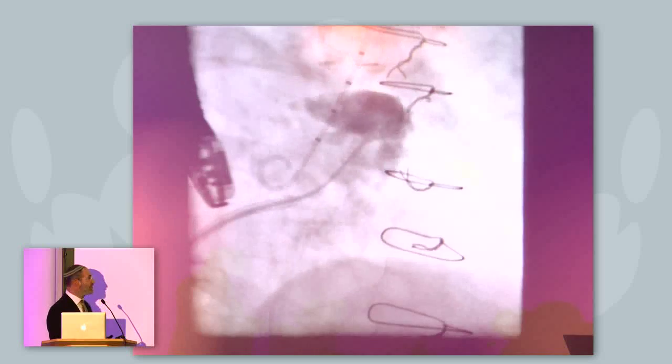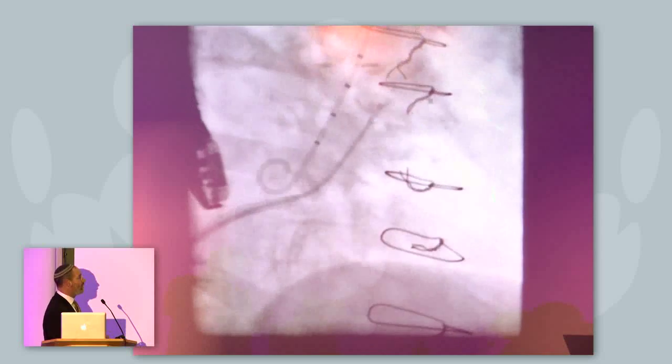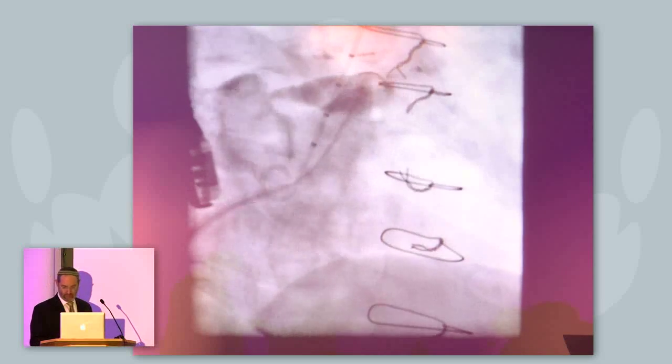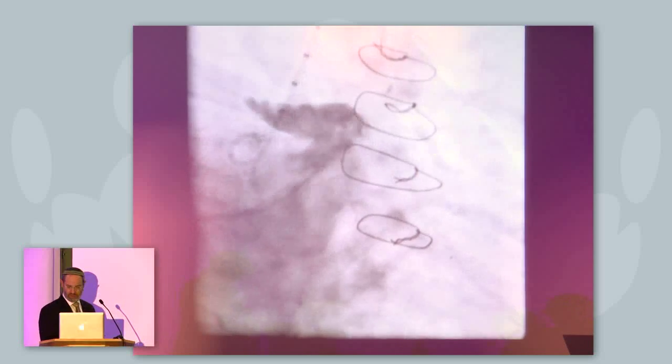And if we do our first injection, we can see a couple of very interesting things. This is a chicken wing, but the chicken wing, instead of going this direction, is going this direction. This is an AP view. The other thing that's of interest that you should have a look at, I think you see now in the straight RAO view, is if you can see, oh, I think it's being cut off.